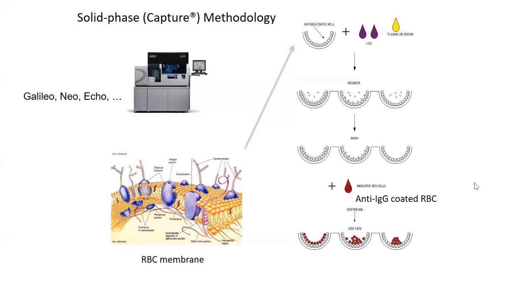After an incubation and washing, the proofing of whether or not your patient has antibodies binding to that cell of interest is going to be an indicator red cell that has Coombs reagent.